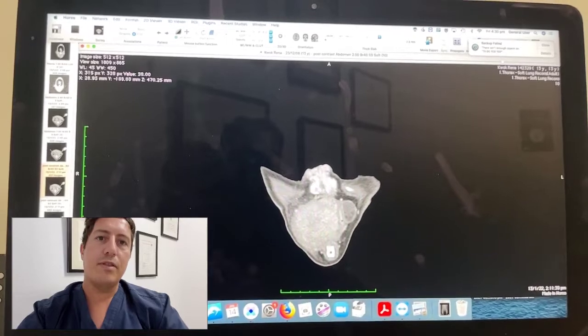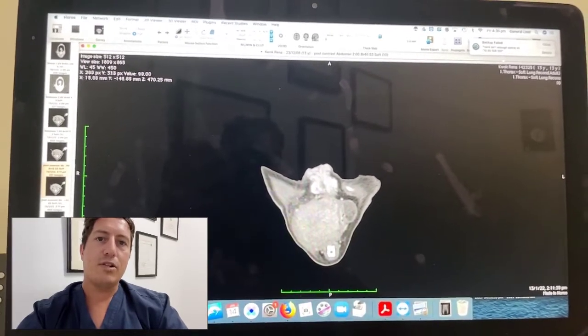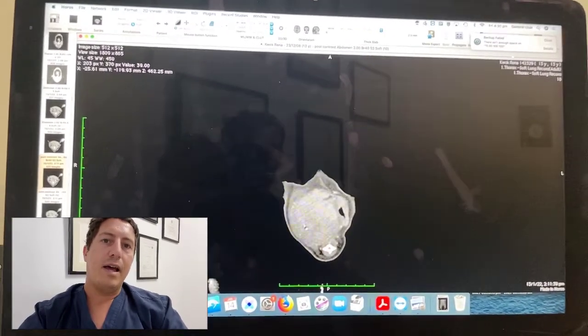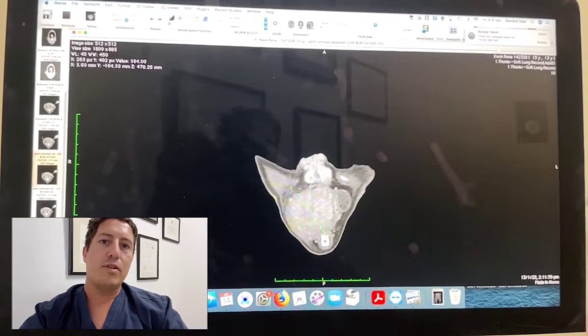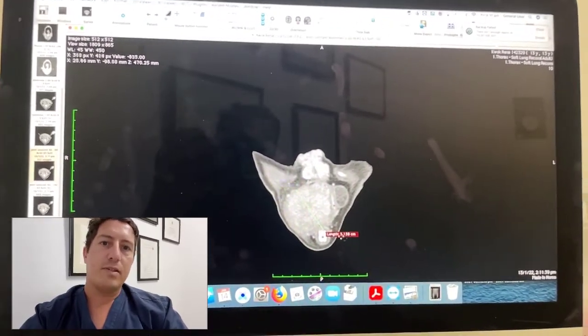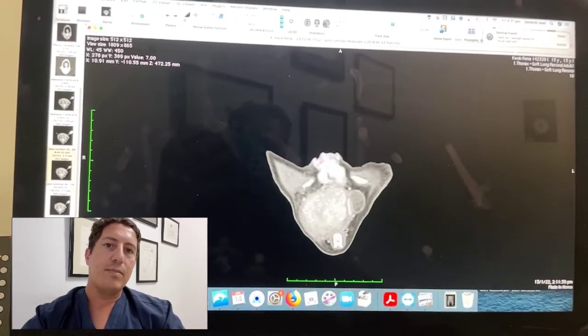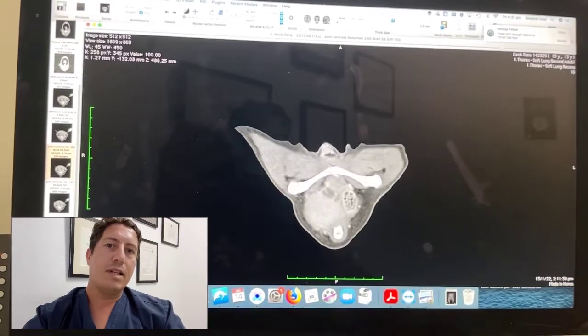We've actually got this other thing here, which is on the left side, so the mass is on the right side. This other thing is actually material in the contralateral anal sac, but you can get an indication of how big this mass is, and it's really pushing on the rectum quite dramatically. This mass is about 5.1 centimetres, probably about 5 centimetres in this direction as well. So pushing on the rectum, and we did the surgery, and this thing came out without too many problems.